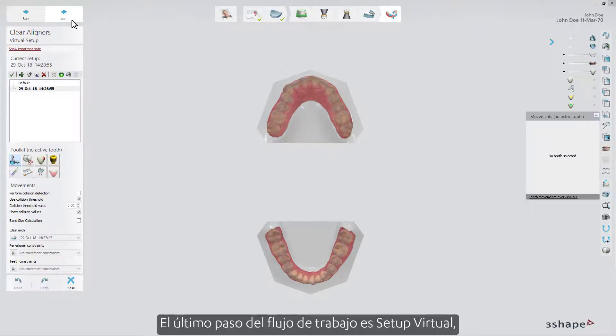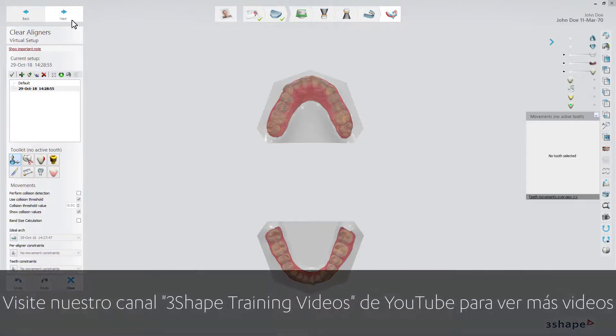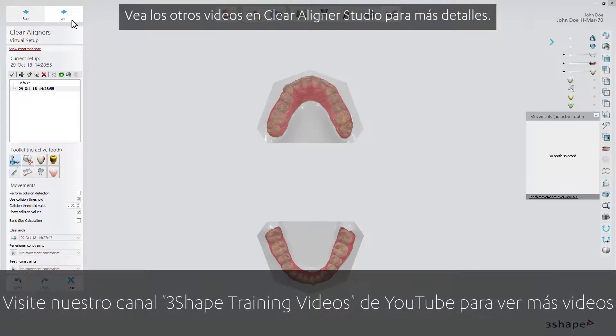The last step in the workflow is the Virtual Setup, where you are able to build your ideal setup and all the stages leading to it. Please see the other videos on ClearAligner Studio for more details.